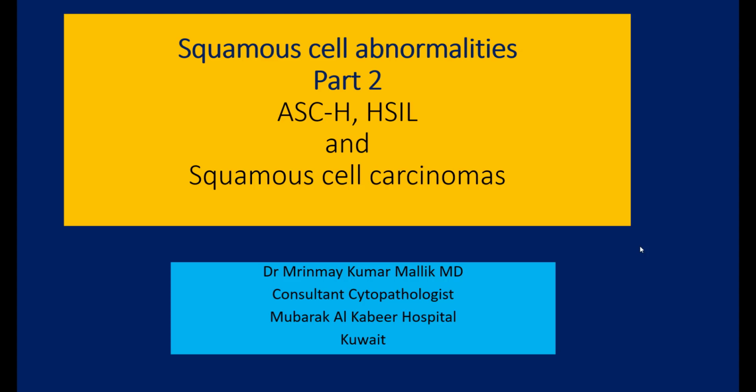Hello, welcome to part 2 of my lecture on squamous cell abnormalities on cervical smears, in which I shall be talking about ASC-H, HSIL, and squamous cell carcinomas.